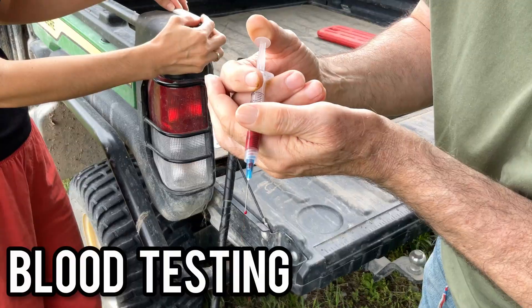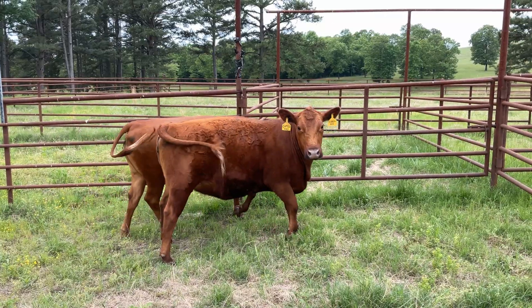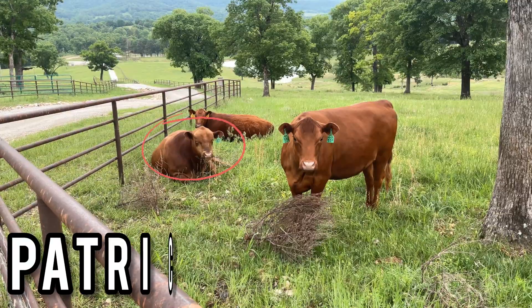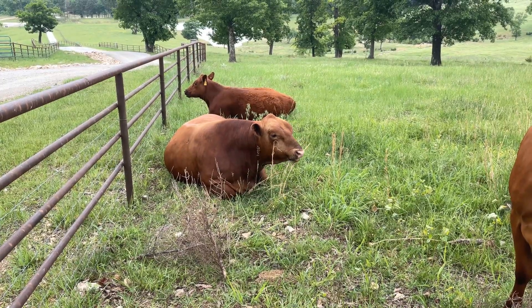Today on That's Farm, we are going to be blood testing two heifers to see if they are pregnant. These two heifers were not pregnant out of the 20 cows we preg-checked months ago. We left these two heifers with our bull, Patrick, to see if he could try again and do his one and only job here on the farm.